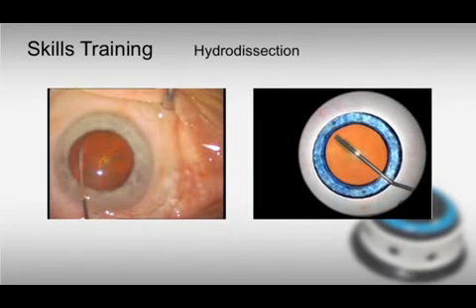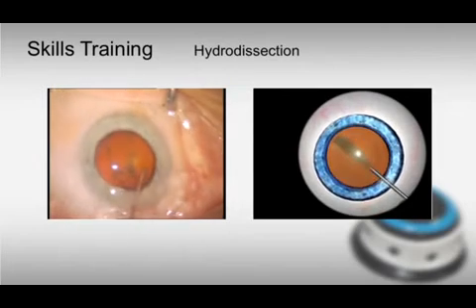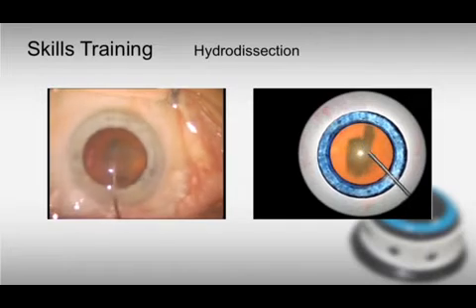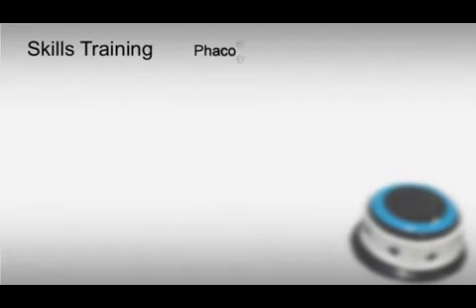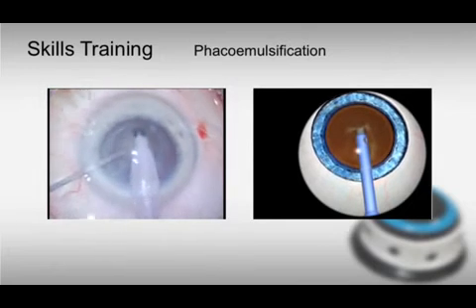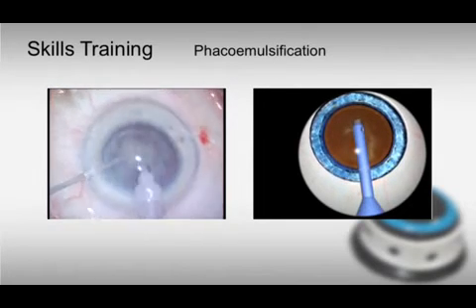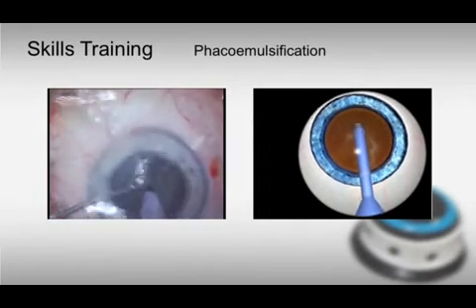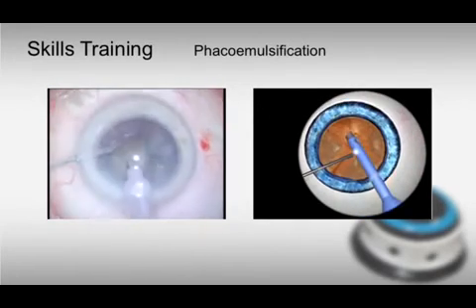Hydrodissection, including rotation of the nucleus. Finally, phacoemulsification, including divide and conquer technique, and quadrant removal.